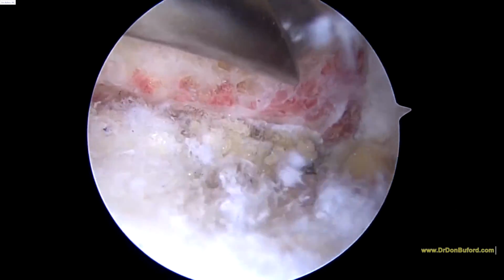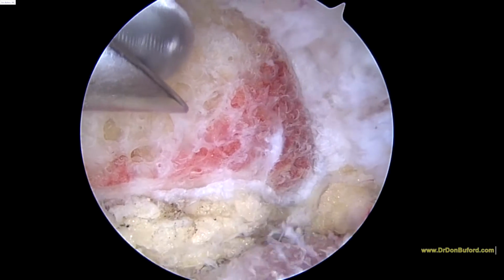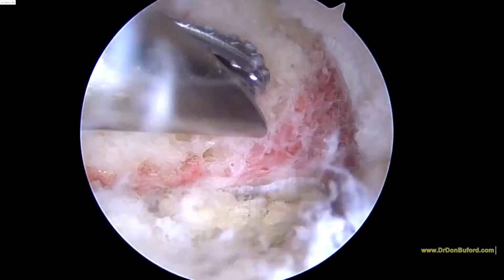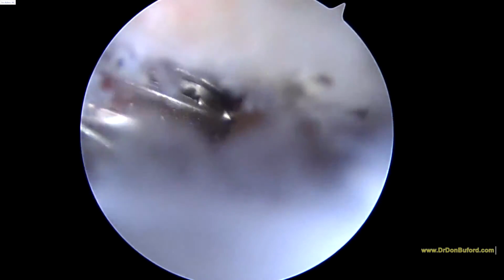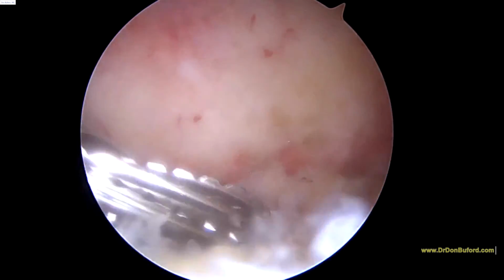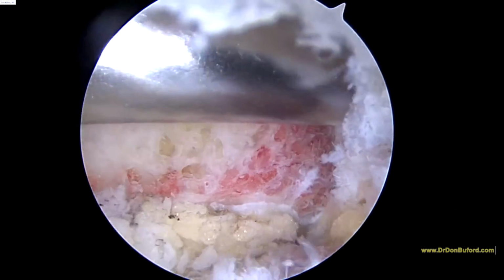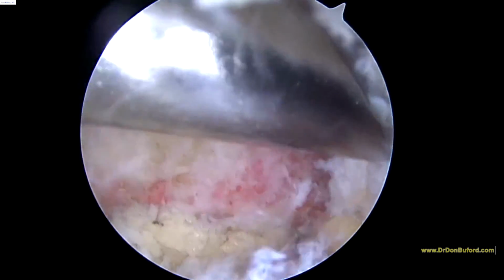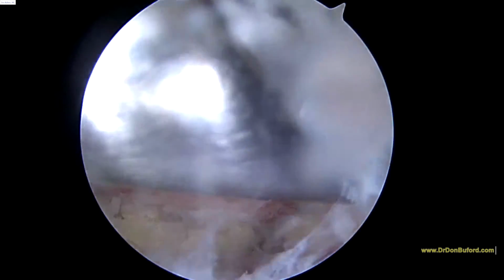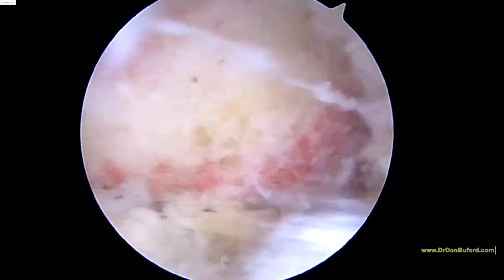We've taken off a little bit of bone from the acromion, and what we're actually showing you here is our decompression of the AC joint. This is the clavicle on the left. The acromion's actually on the right, back over here. Let me get back into the picture here. And so now we've got plenty of space between the acromion and the clavicle, at least 6 millimeters, probably actually closer to 7 or 8. Taking a little bit more bone off the acromion in the back right here. Okay, so that looks good.